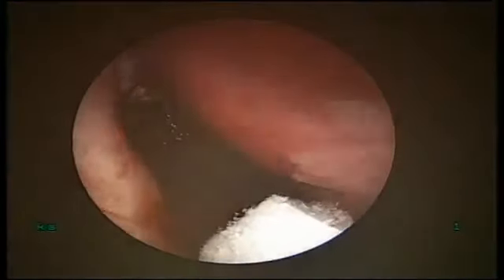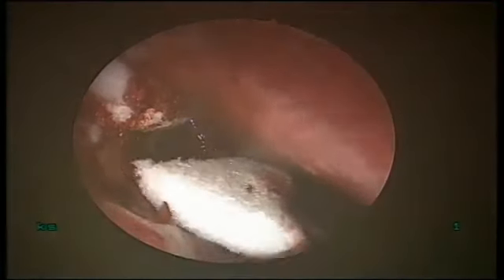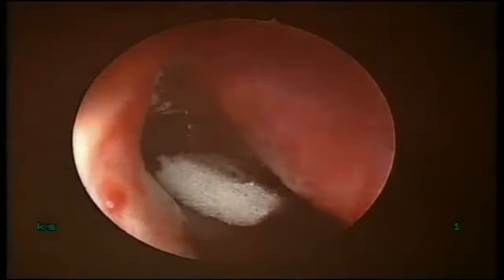And lastly, for the lower part of the flap, that is just above the inferior turbinate. See this? The main flap is divided into two, upper and lower.